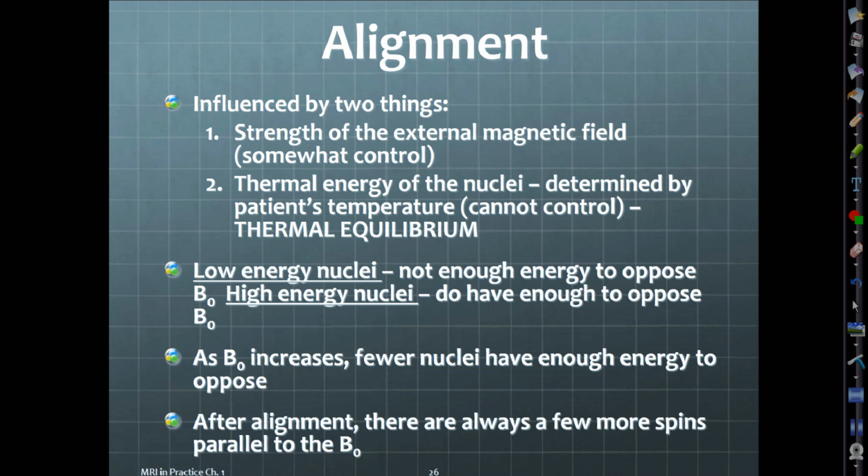We don't really have to consider this until we're doing IR procedures. And it's pretty cool because we're heating up tissues and cooling down tissues based on various procedures that they're doing. And that patient temperature will influence relaxation rates and alignment of those spins. So they're able to actually get some information from those tissues based on the temperature of those tissues. So it's pretty cool. But that's really only something that we consider when we're dealing with IR, MRI procedures.